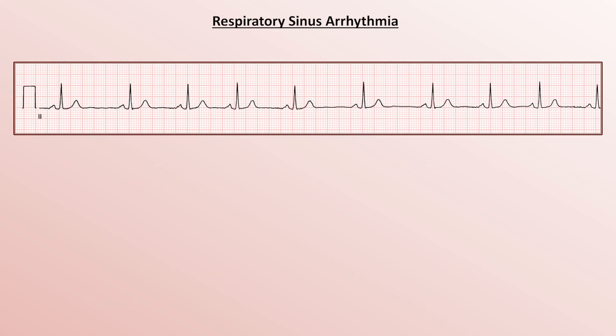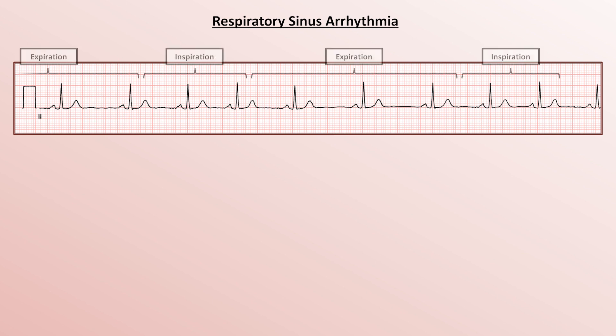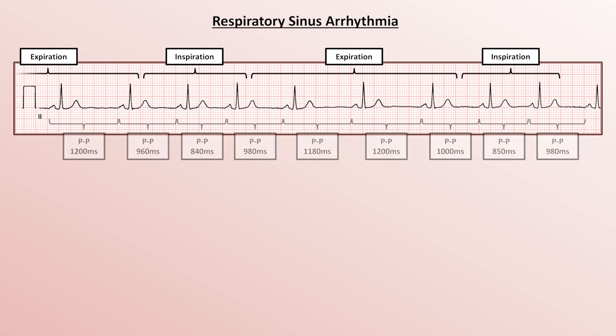Here's an example of respiratory sinus arrhythmia. To help understand what's going on, I'll label when the patient is expiring and inspiring. As you can see, the sinus rate increases during inspiration and decreases during expiration, with a relatively smooth transition in rate. This pattern is caused by changes in vagal tone secondary to complex reflex mechanisms interconnecting the pulmonary and cardiovascular systems.